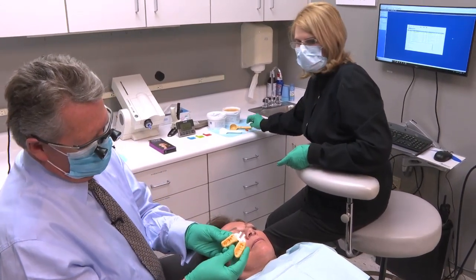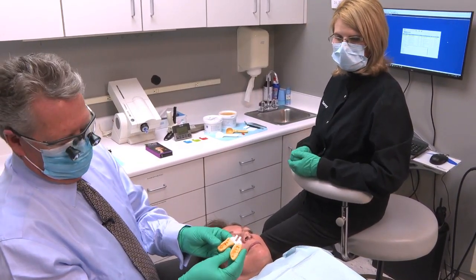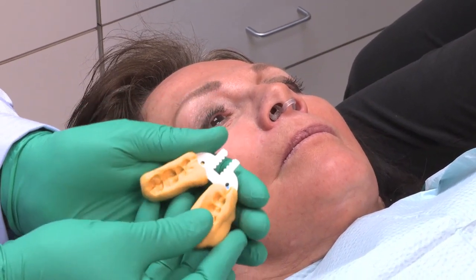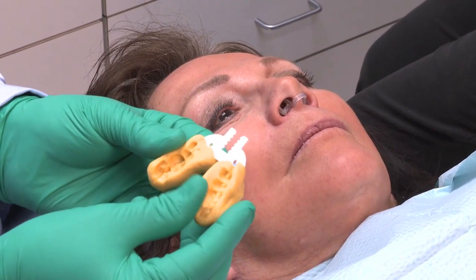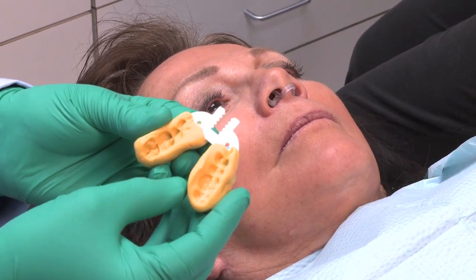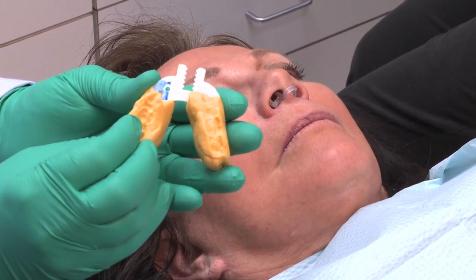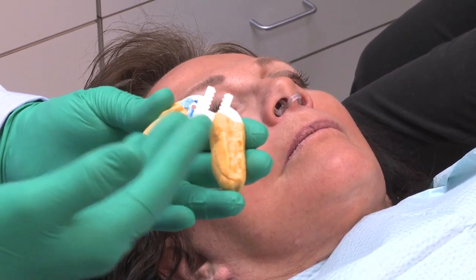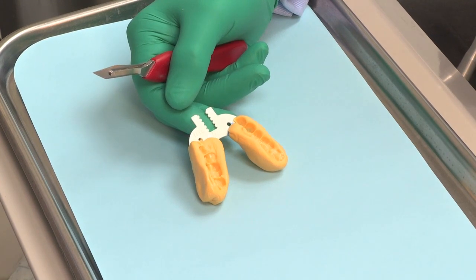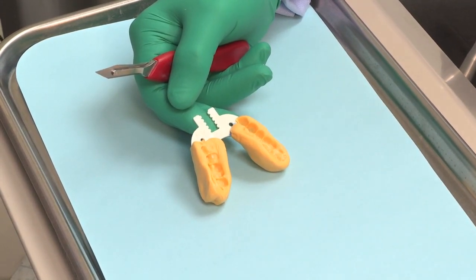And here is our index. So we have nice indentation of the maxillary teeth as well as the mandibular teeth. What we're going to do now is trim this and then reseat it in her mouth and verify that it fits and check her midlines. So you see we have a nice representation of the bite registration. The Panasil putty does an excellent job of doing that.